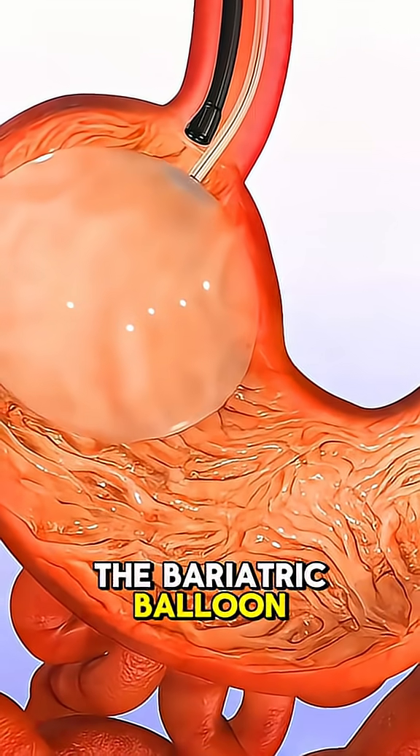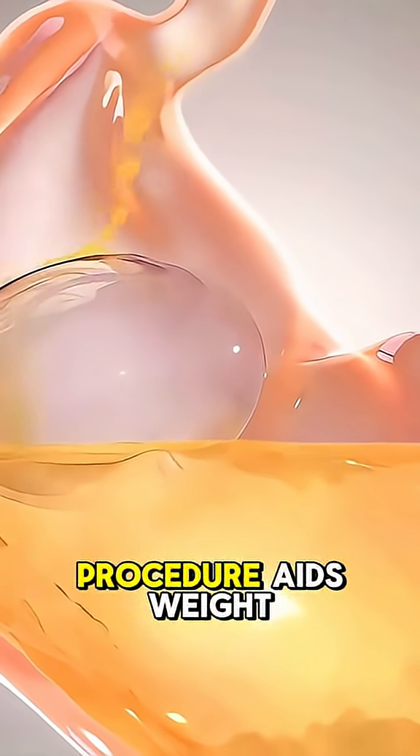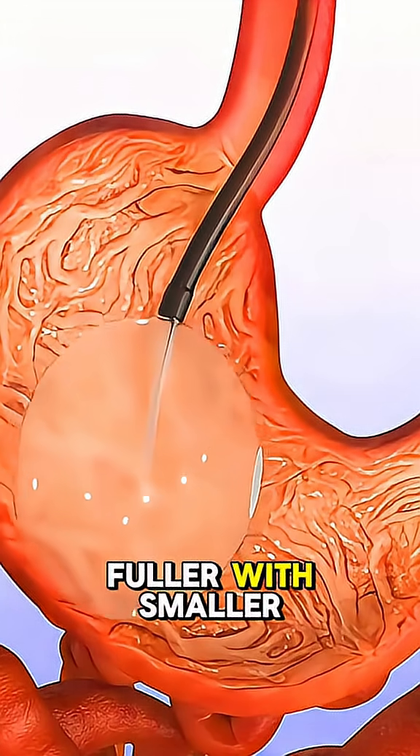Ever wondered how the bariatric balloon procedure is performed? The bariatric balloon procedure aids weight loss by inflating a soft balloon in the stomach, reducing space and helping patients feel fuller with smaller portions.